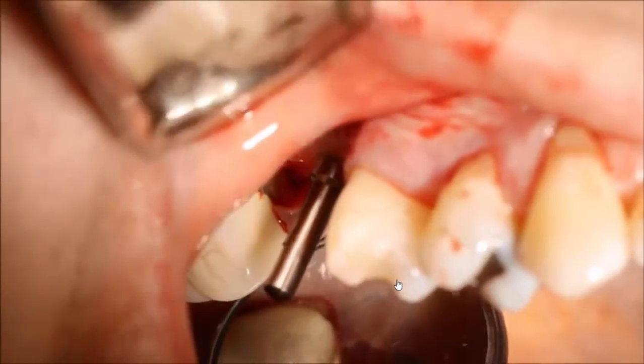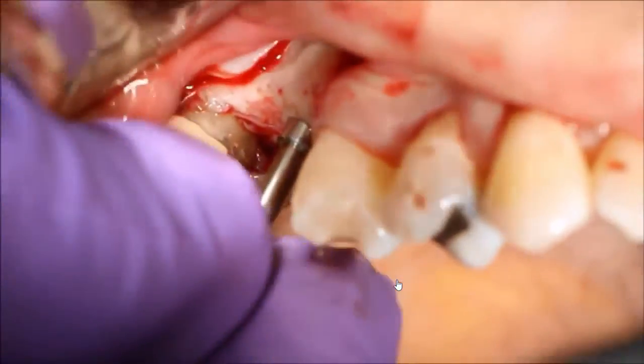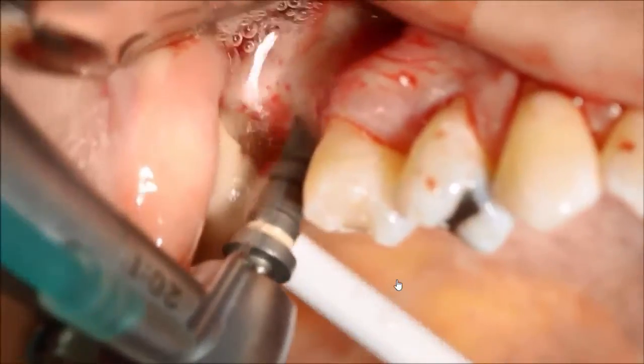On the parallel pin, just to make sure that I have good direction and good position. Now we are extending the osteotomy.